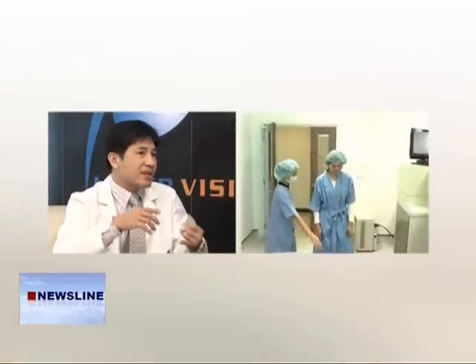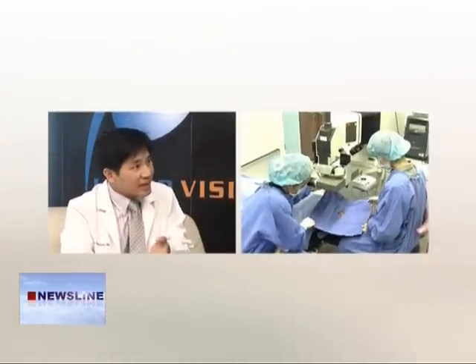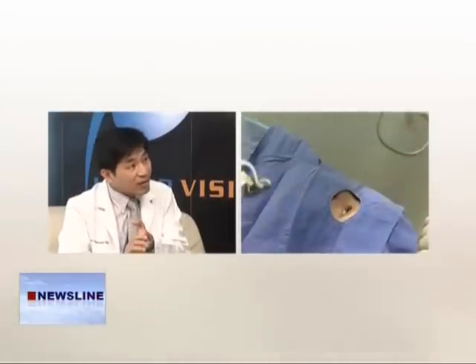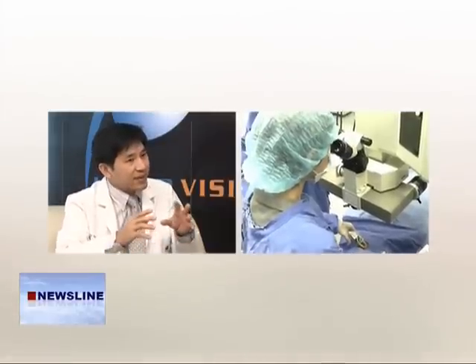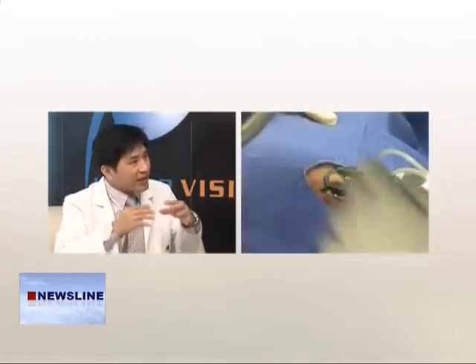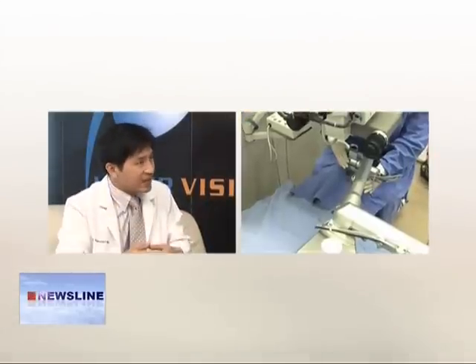I see. Now, is it able to cure all eye problems from farsightedness, nearsightedness, and even astigmatism? Yes, the LASIK operation can treat nearsight, farsight, and astigmatism. Not only that, but also presbyopia. Presbyopia is when people cannot read up close when they get older, such as above 40 years old.